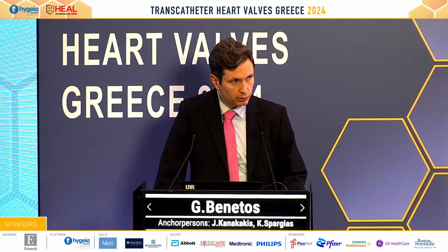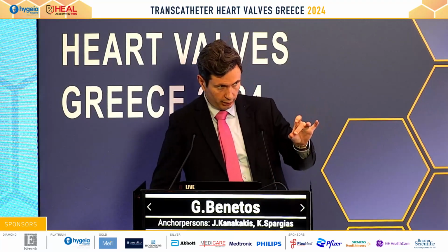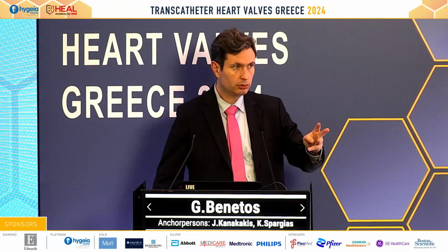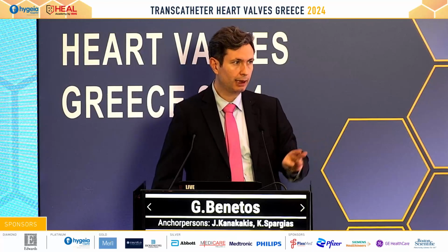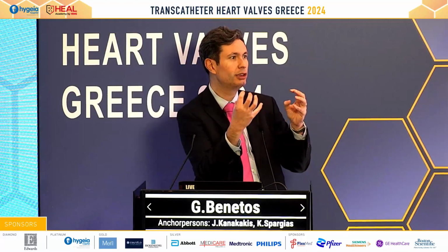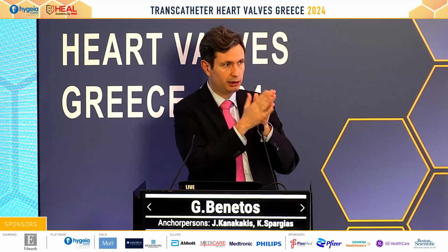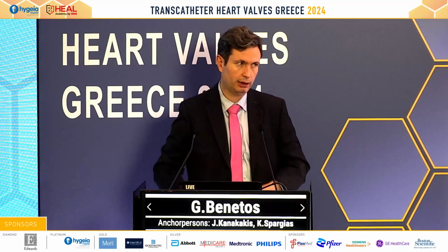I would like to ask how accurate is the measurement of the calcium in the outflow tract in order to avoid some ruptures? In calcium score scanning, it's sometimes difficult to distinguish between outflow tract calcium and aortic valve calcium. So sometimes you cannot exactly, because these are in continuum actually, these masses are connected, so it's difficult to delineate where the aortic valve stops and the outflow tract starts.